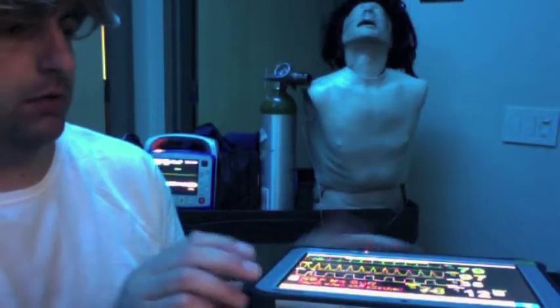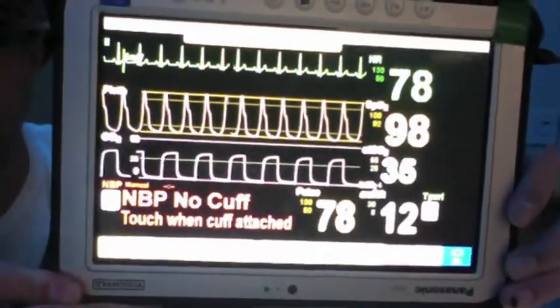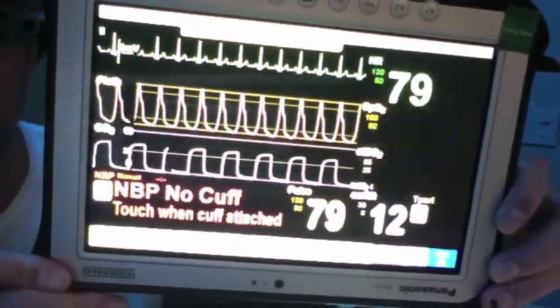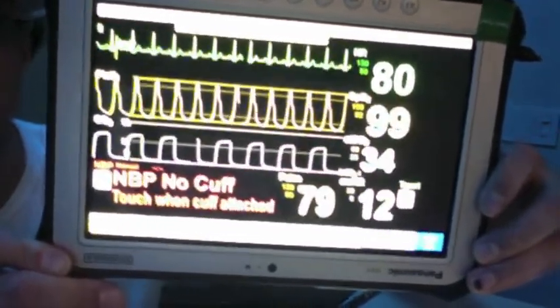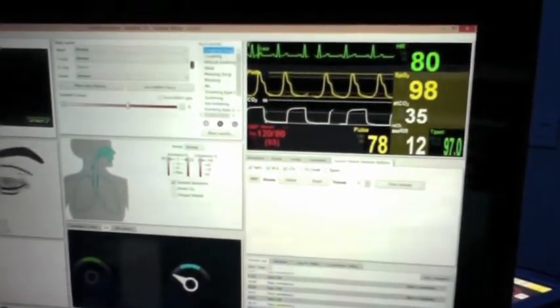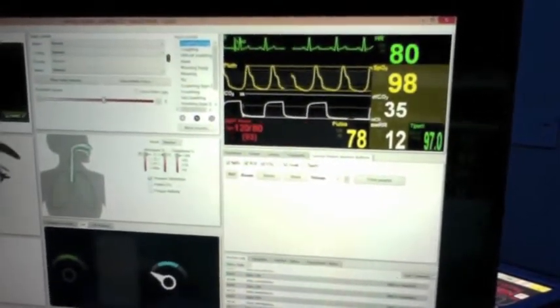Okay, we will reevaluate our asthmatic patient a few ways. One, of course, is our numbers and our screens. So our capnography has returned to more of a plateau. Our respiratory rate, pulse ox, end tidal are all kind of returned to normal values. And just to show you what another normal end tidal tracing looks like, nice plateau looking, normal inspiratory and expiratory.